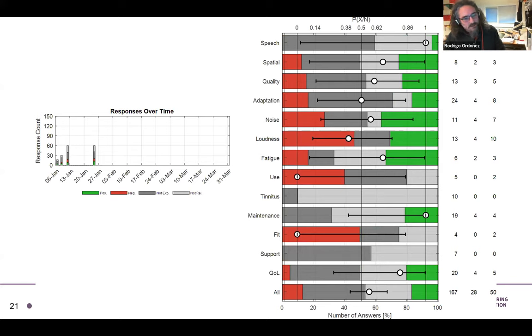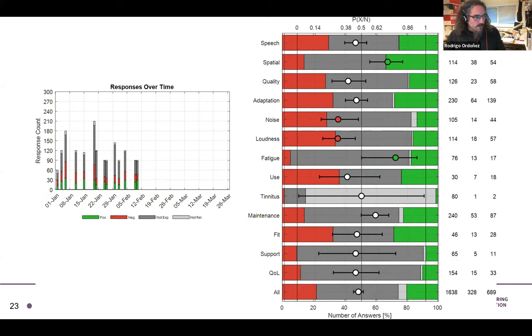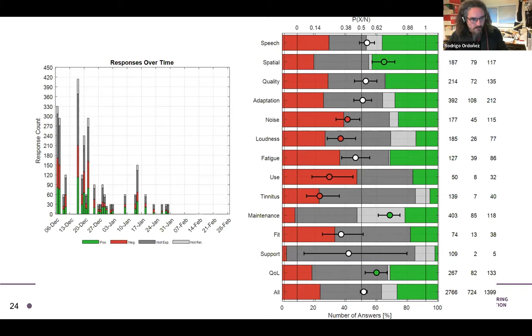And then we can see also here as well, very little responses with time, and other subjects or patients that actually engaged the system rather much in the beginning, but then just didn't care about it later. Here's another example of rather sporadic engagement, but each time for a long time. And here also another example.